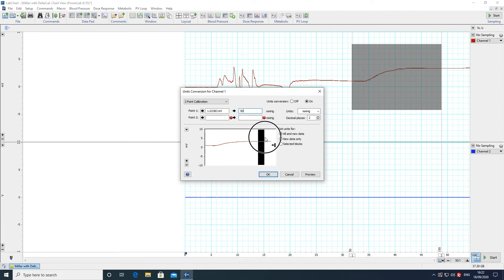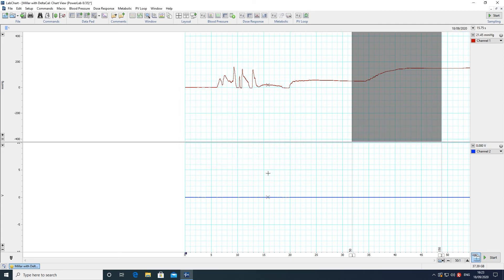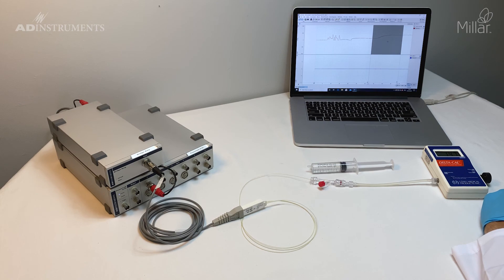Then select the last part which was 150. My units are millimeters of mercury. Click OK and now I'm ready to record pressure. The system has been calibrated.